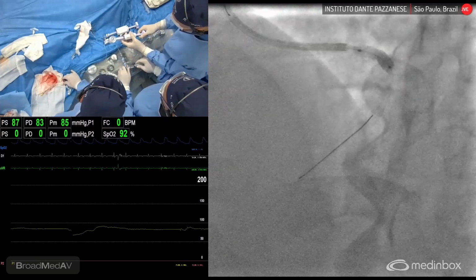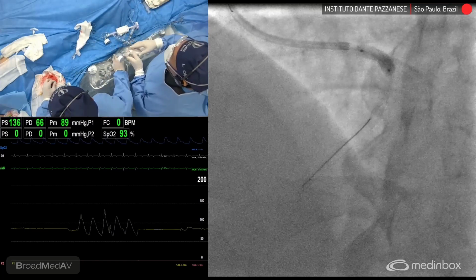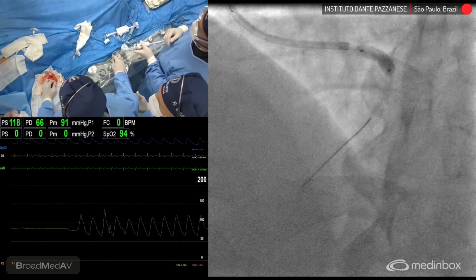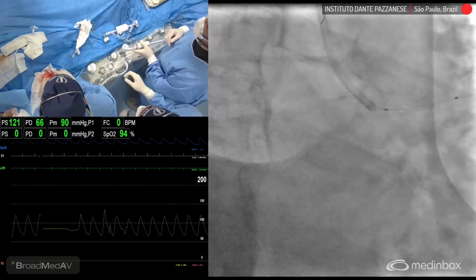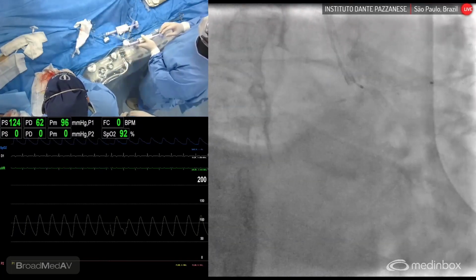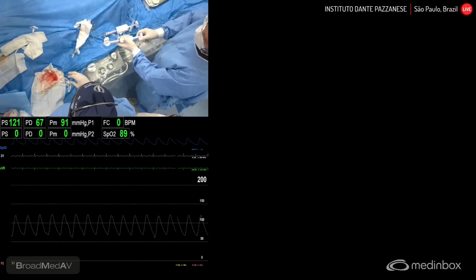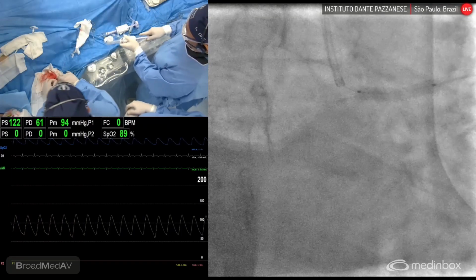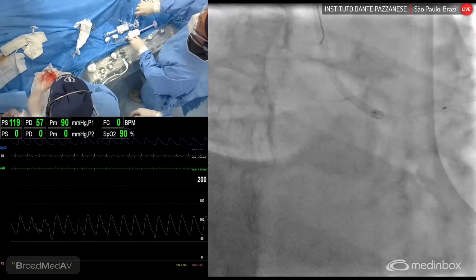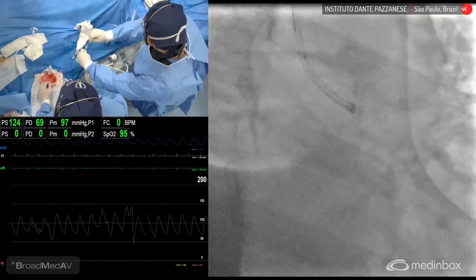Okay. So we go up to 10 atmospheres. That's enough. Then we can change the view here, and you can also use this balloon, right, Rodolfo, to post dilate, sort of like a pot, a little bit back here, right to the aorta. Okay, pot dilatation, 12, 14. So high pressure: 14, deployed with 10. There's a 4.0 by IVUS. Now you went to 14, and I think you're just in the perfect position there.